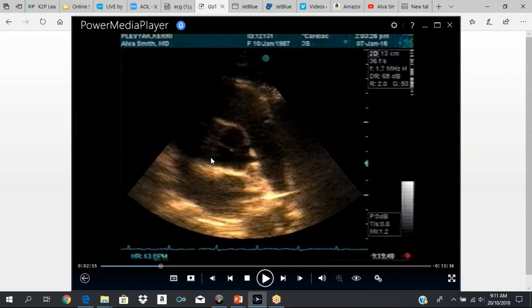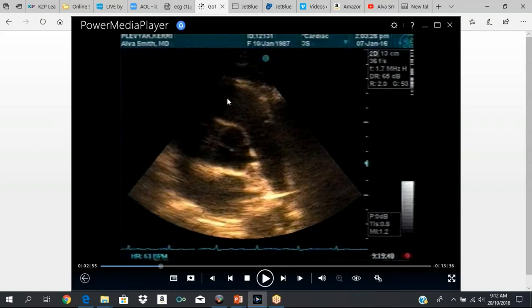This is the short axis at the level of the aorta. With the transducer in the third or fourth left intercostal space, you're going to do clockwise rotation — rotate the probe clockwise to the 1 or 2 o'clock position. The angle of the transducer should be downwards. This is your aortic valve in the center. Towards the right, you have the pulmonary valve. This is your right ventricular outflow tract, pulmonary valve, and main pulmonary trunk. On this side, you have your tricuspid valve, the right atrium, and your atrial septum.